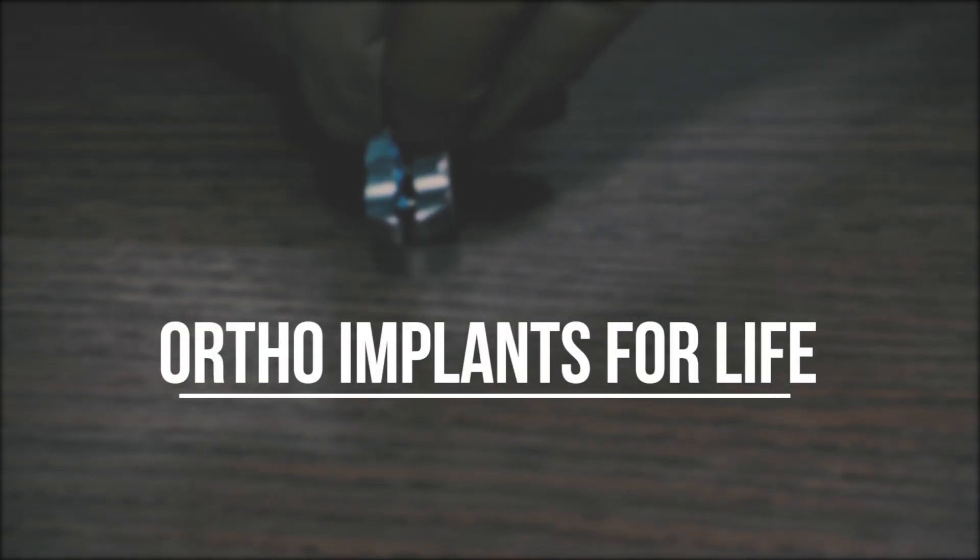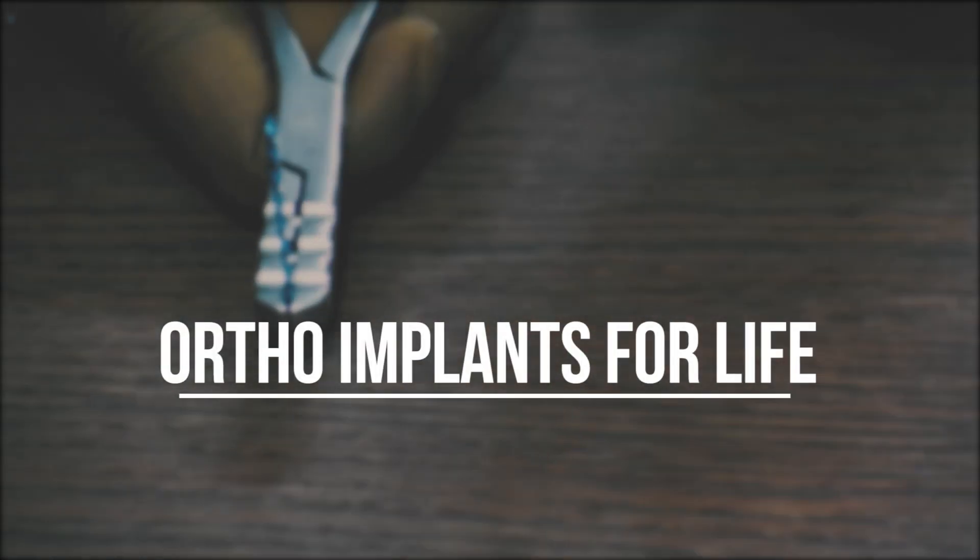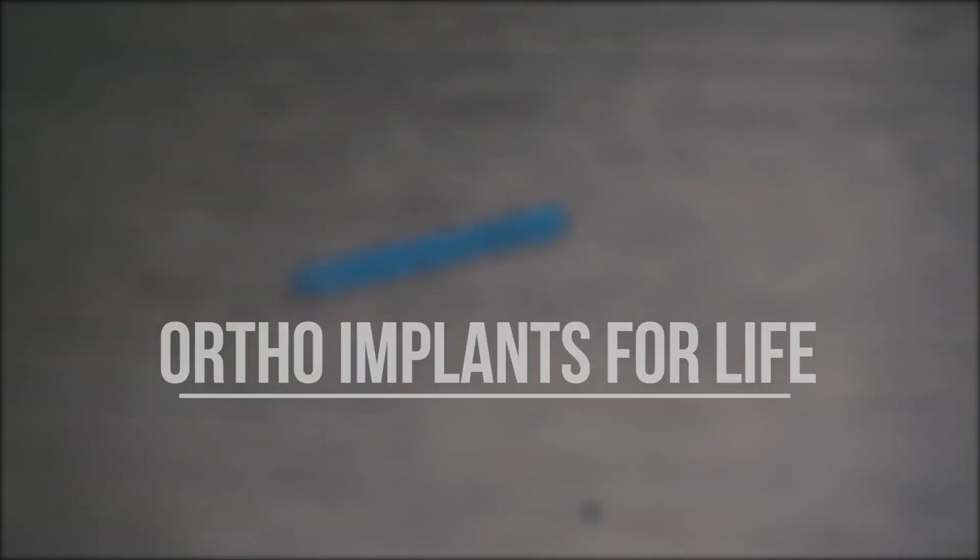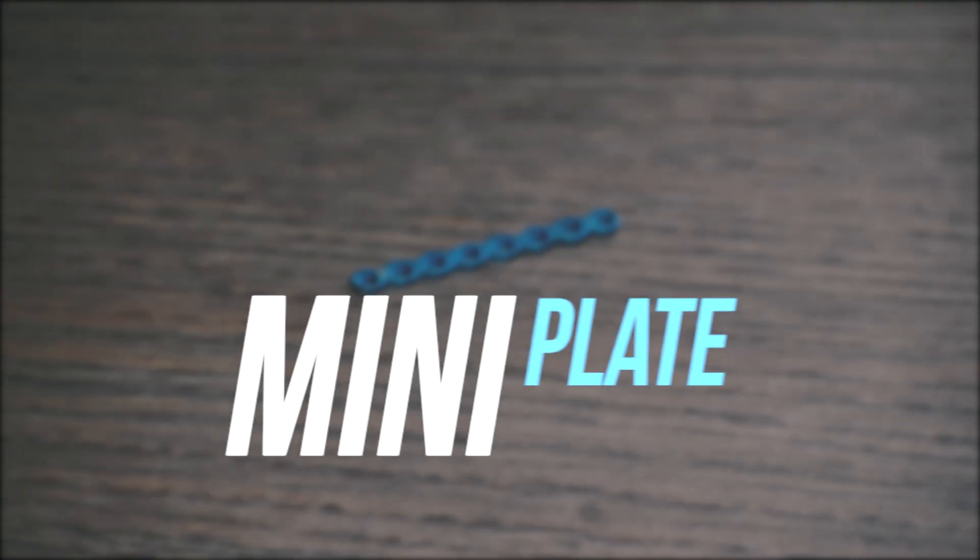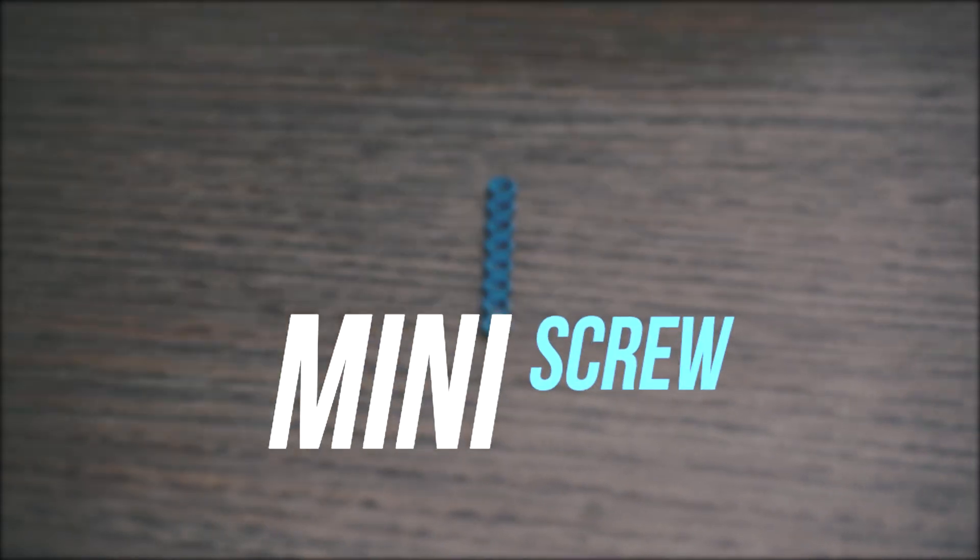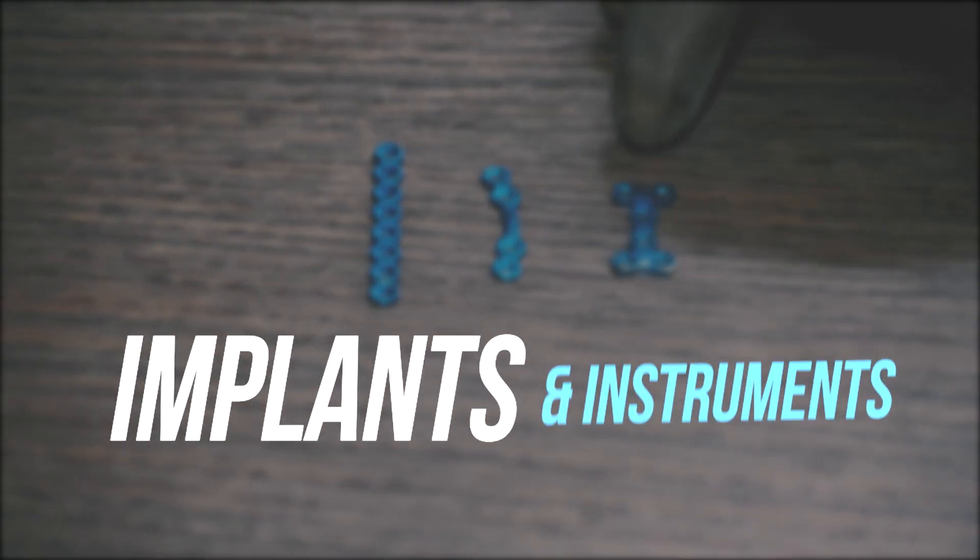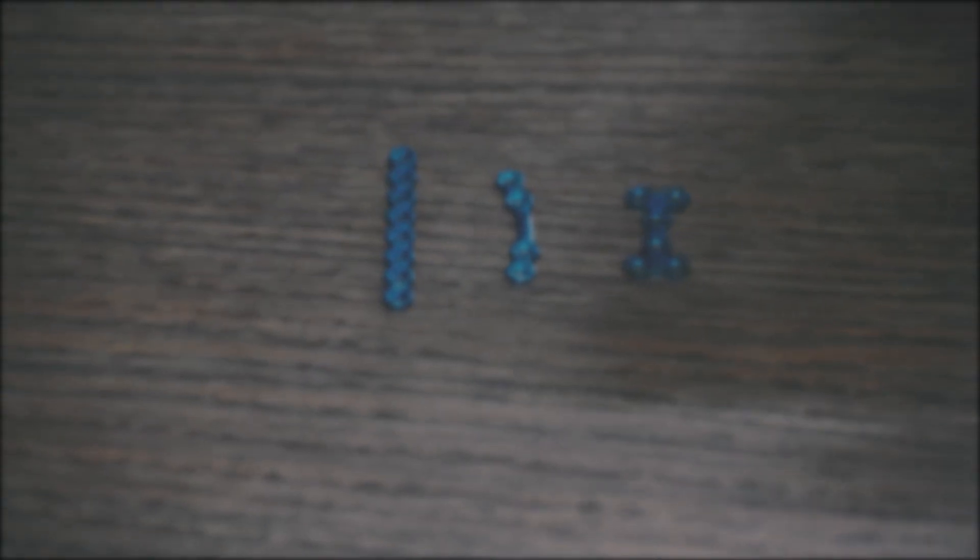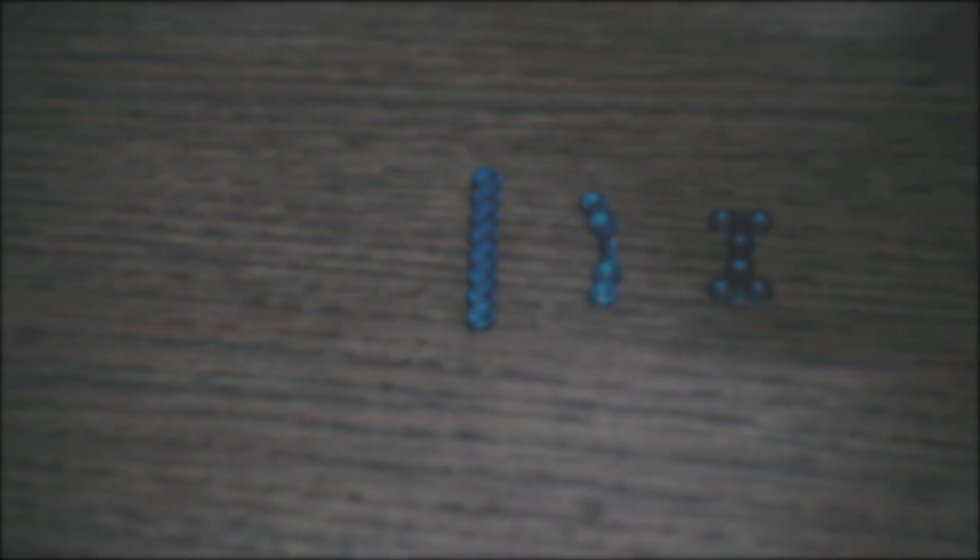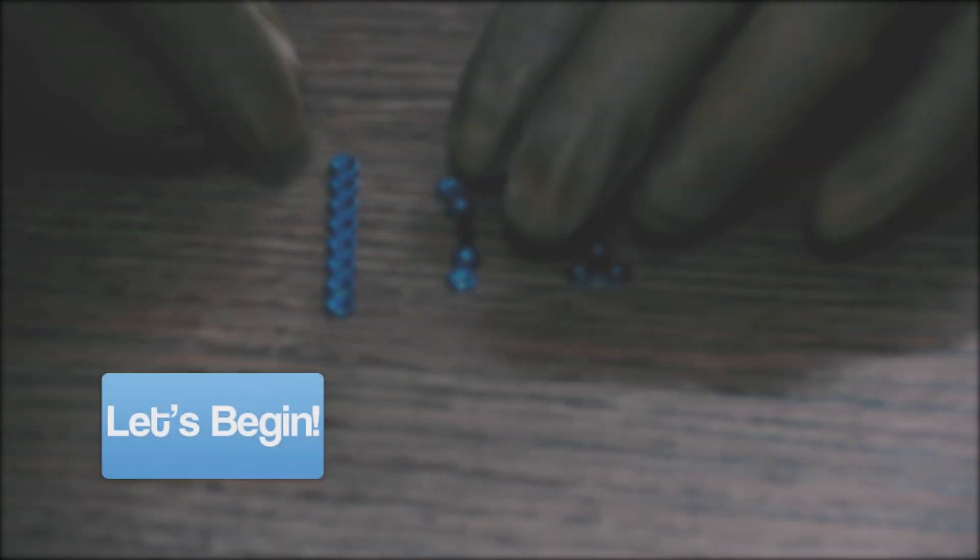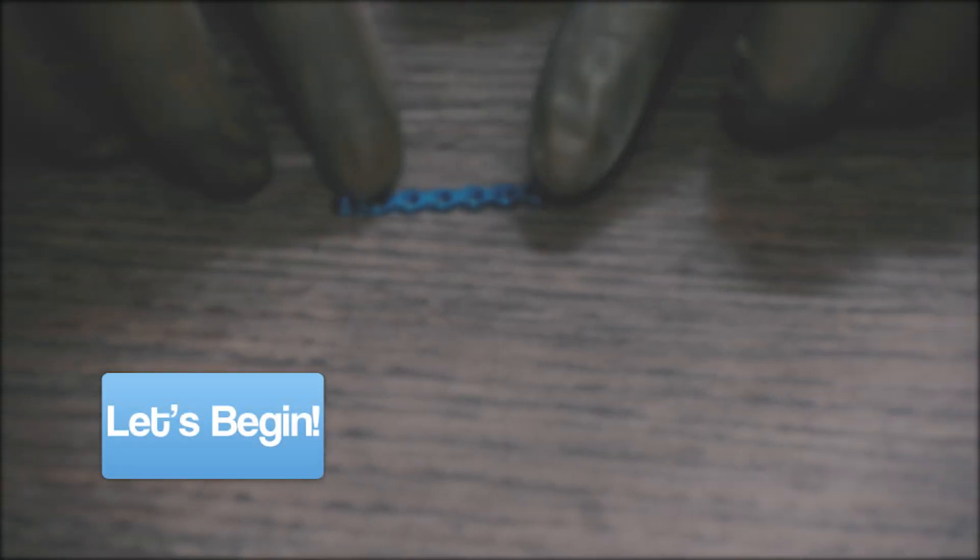Hello everyone, welcome to Ortho Implants for Life. Today we will discuss mini plates, implants and instruments. So let's begin.